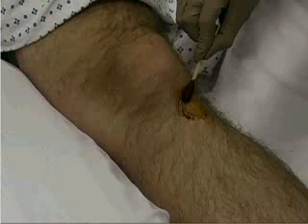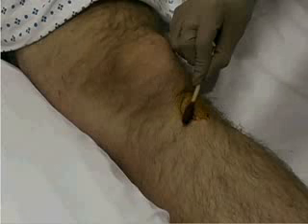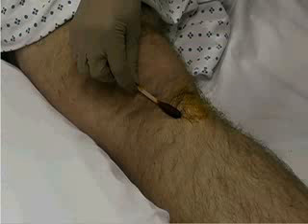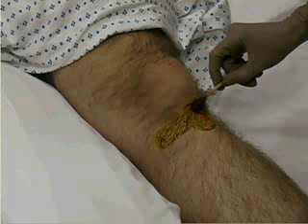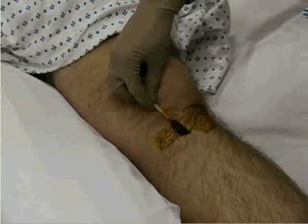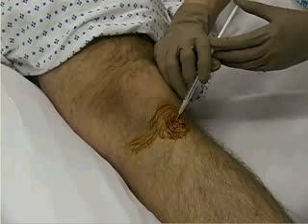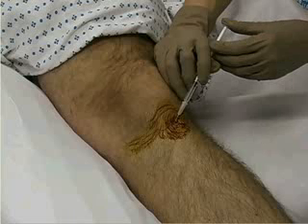Prep the area where the needle is to be inserted. Start at the tibial tuberosity and proceed linearly toward the tibial condyle. Repeat the prep 3 times, allowing the prep solution to dry before needle insertion. Using a tuberculin syringe and attached 25-gauge needle, create a wheal with 1% lidocaine in the cutaneous tissue over the tibial tuberosity.